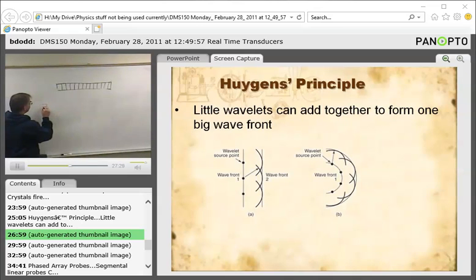So if I have a narrow diameter, remember, it's going to send out a wave, and it's very quickly going to focus, and then it's going to diverge, right? And remember, this distance between the focus and the crystal is called the near zone length, right?